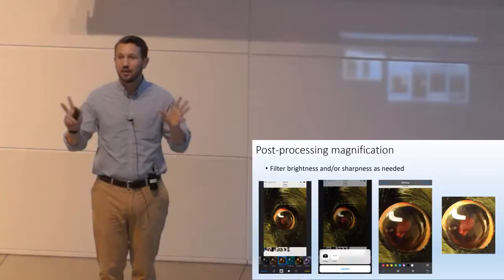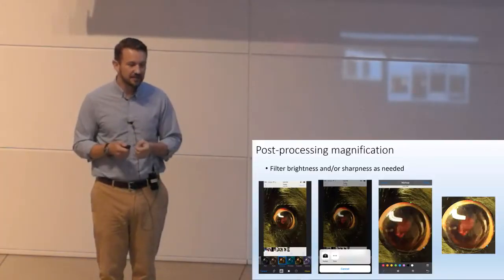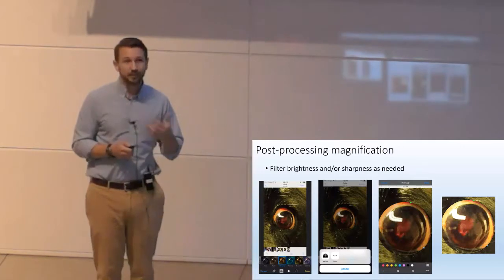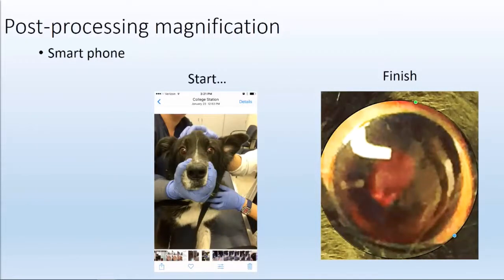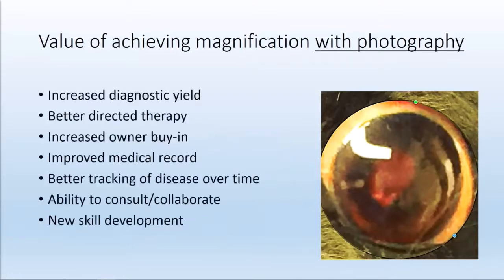I know these things do not apply to shelter medicine, but I'm just letting you know that we have at least a direction to take the case, or at least to treat it empirically. This is a neopolydex eye rather than an optimune eye. So start to finish, just in seconds. Just zoom, screenshot, a couple of adjustments that you really don't need to do, and we found uveitis pretty reliably.